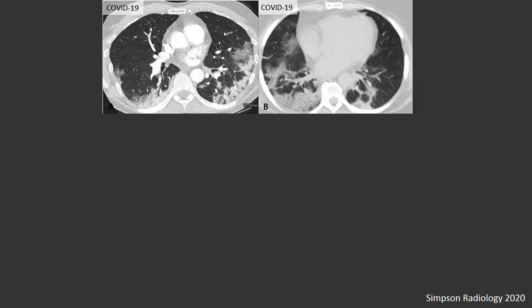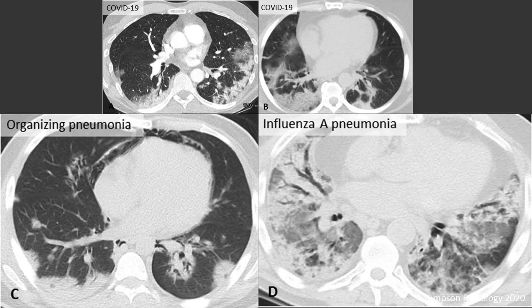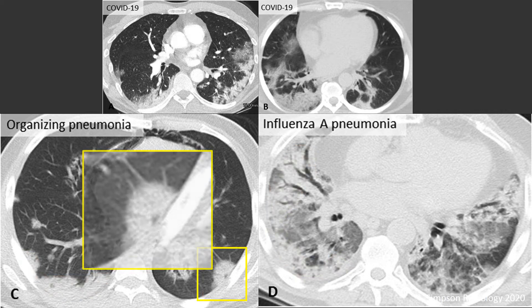It's important to emphasize that these features are not pathognomonic for COVID-19. Here's a case of organizing pneumonia related to dermatomyositis on the left and influenza A pneumonia on the right. Both processes demonstrate peripheral opacities of consolidation and ground glass, with the organizing pneumonia opacity appearing rounded. These imaging features overlap with COVID-19.